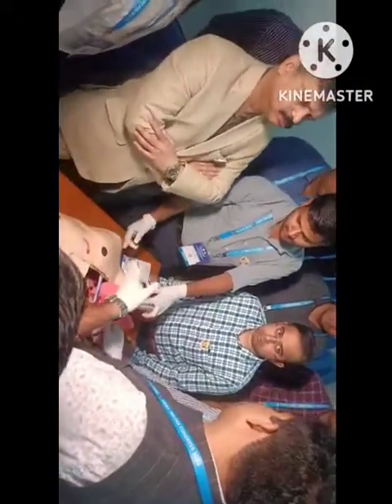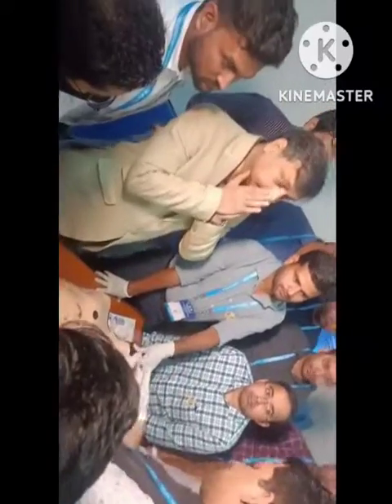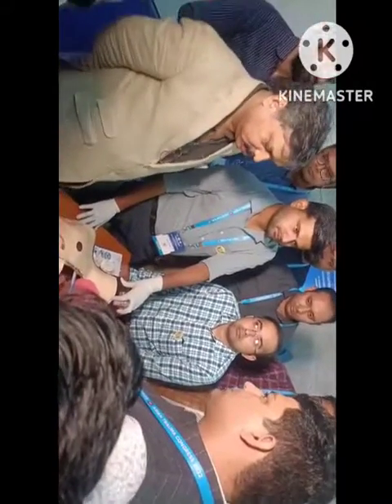I will cut the inferior pulmonary ligament and go across till the spine. Is it necessary to cut it? Or before that, what will you do? Actually, if the patient has an ET tube in before the carina, there is most probably a chance that the lung is expanded. So if you want to approach medially, you have to mobilize the lower lobe. You need to dissect something to access the aorta, so I remove the mediastinal pleura.